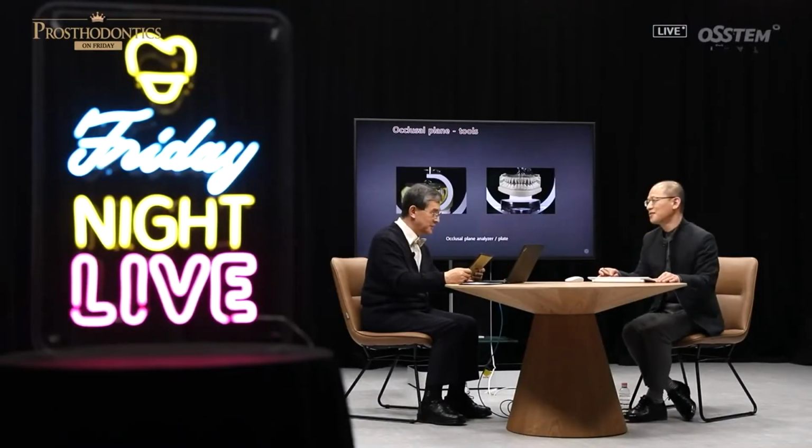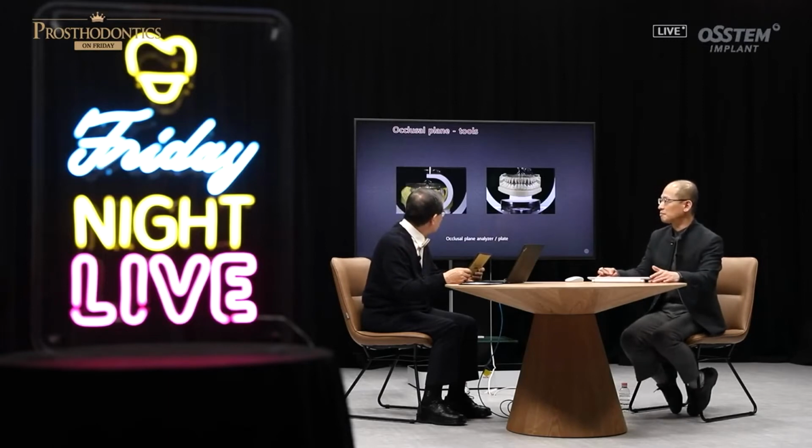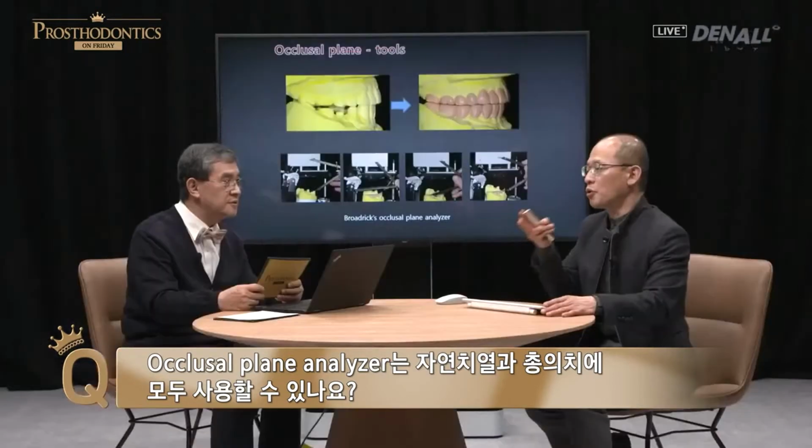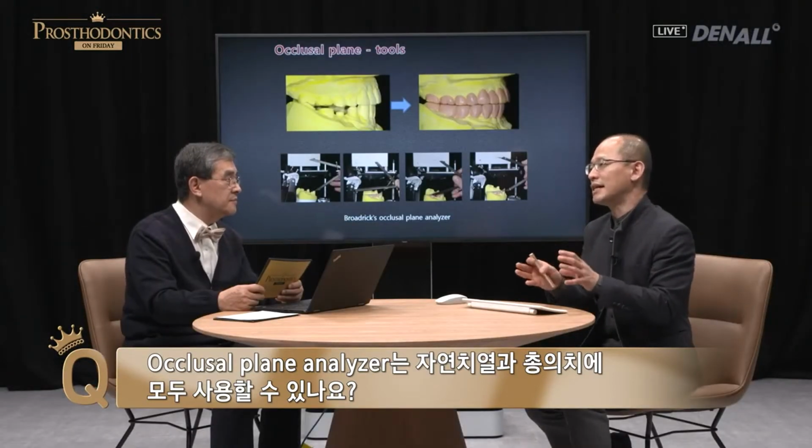Can I ask you a question? Here you use the occlusal plane analyzer. Be it natural teeth or full denture, can you use it for both cases? Yes, I just talked about the occlusal plane analyzer, and that is very much articulator-focused. If it's used with a pen, you can use it. But if you use it just as a tool, then even on the mock-up model there are landmarks, so it's very easy to use.